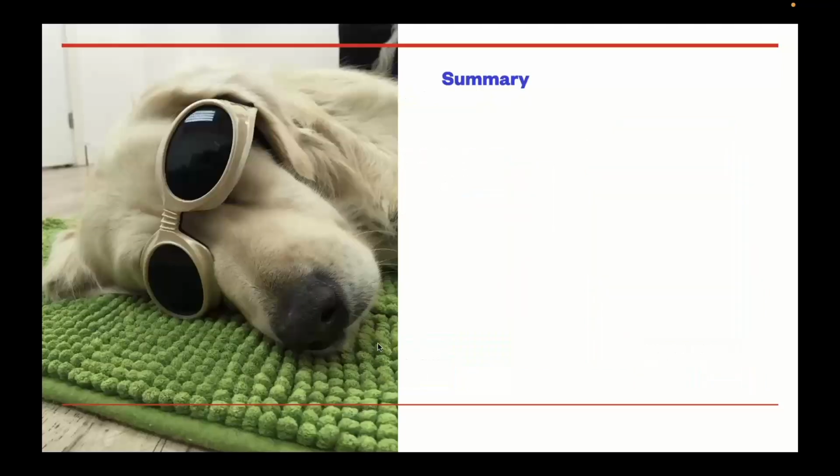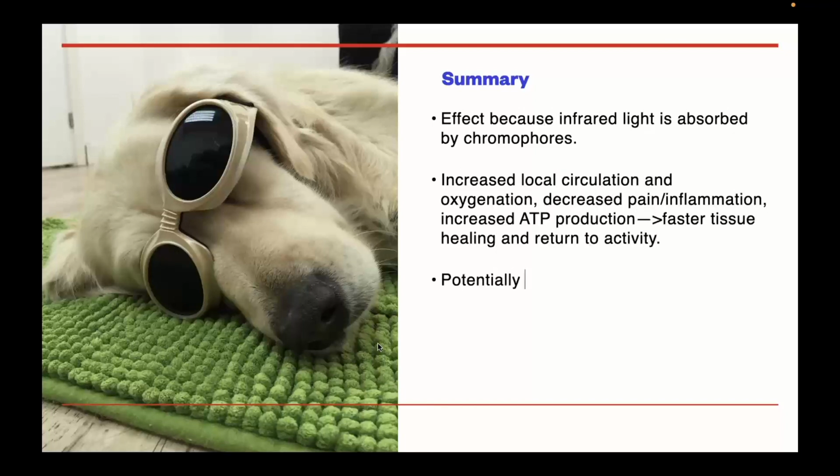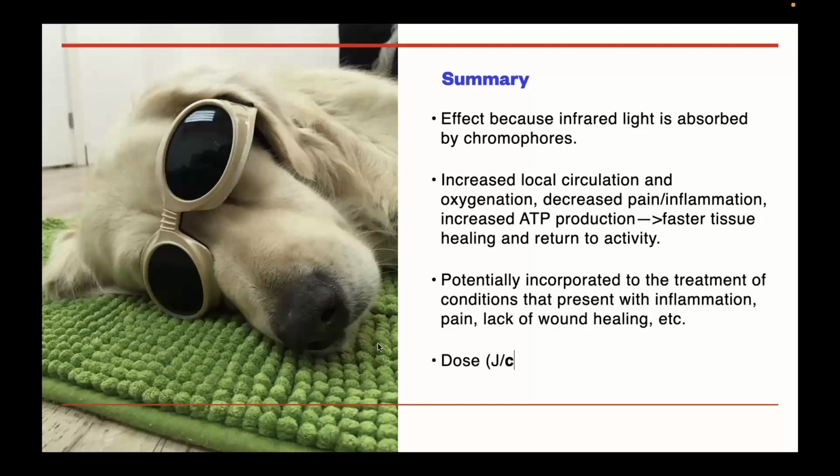So in summary, the effect of laser therapy after being absorbed by the chromophores is that the circulation and oxygenation are increased, ATP production and cell survival increase as well. There is modulation of the inflammatory response. There's analgesia. And all these lead to faster tissue healing and recovery.